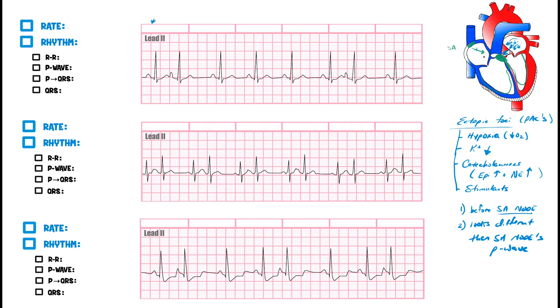Looking at this top EKG in lead II, let's determine the rate. We have a six-second rhythm strip, so we multiply the number of R waves by 10. Counting: one, two, three, four, five, six, seven, eight — eight times ten is 80 beats per minute.